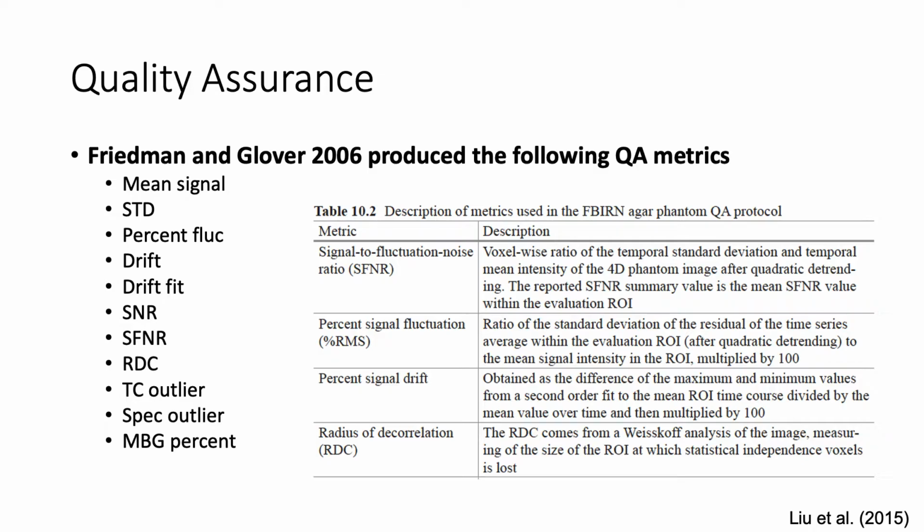Yeah, so if we get into inhomogeneity, or the susceptibility of the field strength, you'll see some signal or spatial distortion in the orbital frontal cortex, maybe in some of the temporal lobe, and so there you might see some changes in a lot of these metrics, and so again, some of those are important regions, right? And so we want to do the best we can to minimize it and then correct for it if we can.